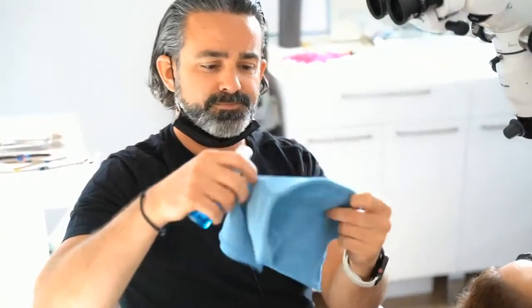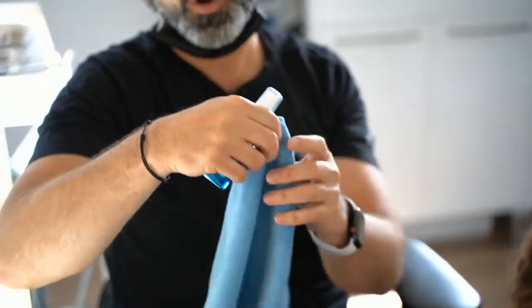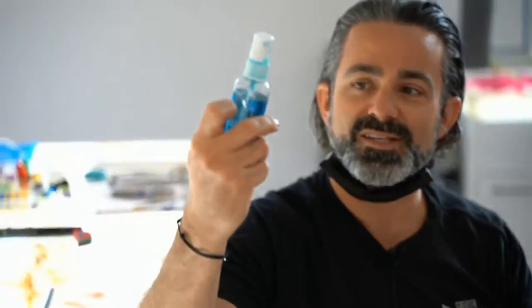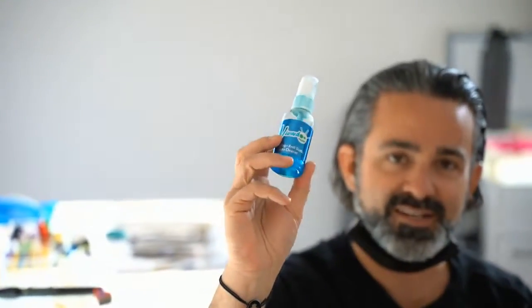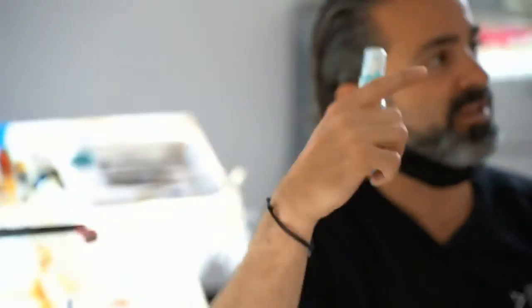The other one is you can always use micro towels and wash them. We have a lot of these floating around, and we use them and wash them. What I've learned to use is an anti-fog, anti-static cleaner. I don't want to sell brands, but it's anti-fog, anti-static cleaner, and it's really helpful for my wispy eyelashes that I keep cutting.